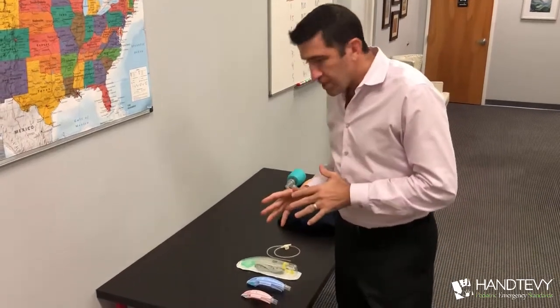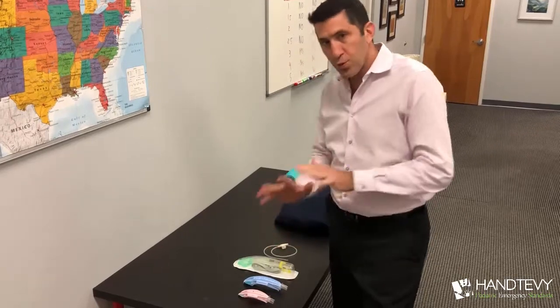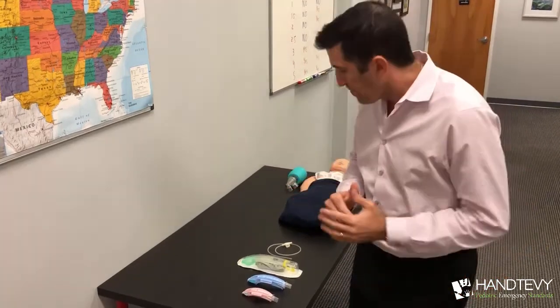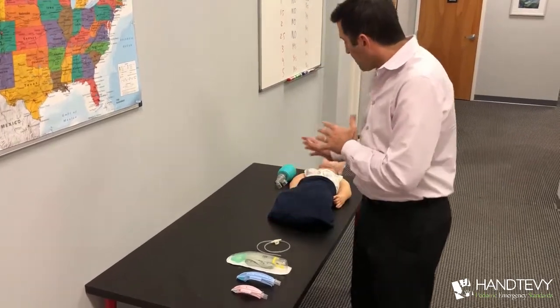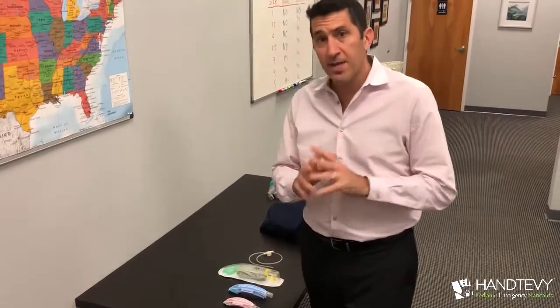So let's talk about the i-gel, which is what I use in my agencies. I have here several sizes, which we'll talk about in a minute, but the i-gel goes from the youngest of children all the way to an adult. I want to show you the differences here. We'll talk about suction with the i-gel, and then I'm going to take you to the mannequin to show you exactly how to utilize this device. At the very end, I'll give you a little graphic on the whiteboard.